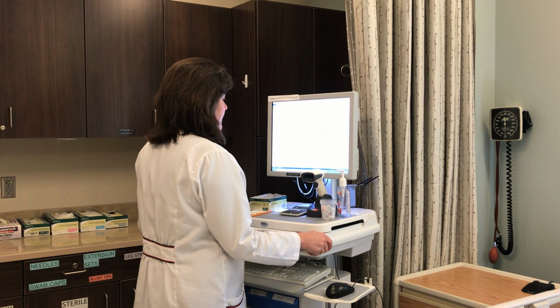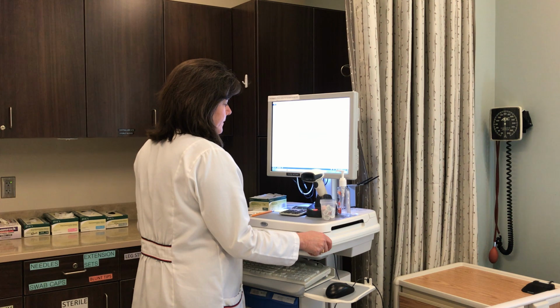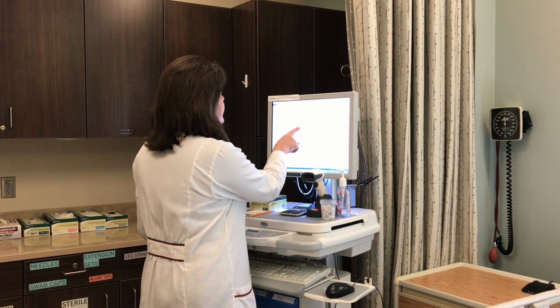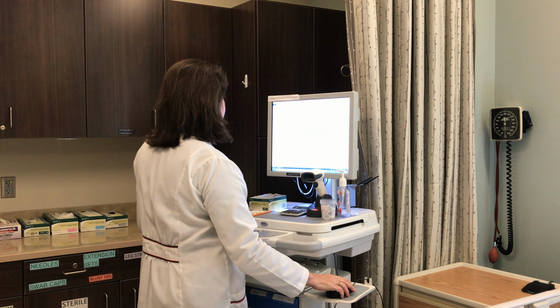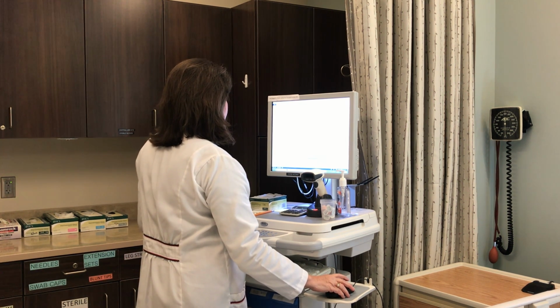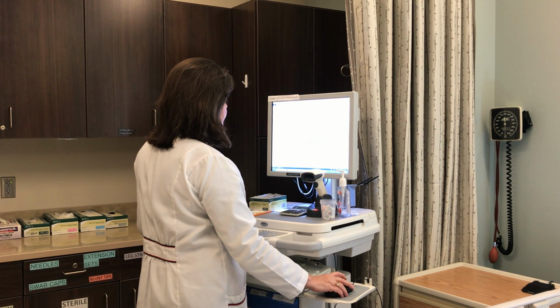This video will demonstrate IV push via peripheral saline lock, INT. Verify MAR and healthcare providers' orders for medication. I'm checking the physician's orders in the MAR for Diane Curtin. The medication ordered is Solumedrol 200 milligrams IV push. Review allergies. The MAR says allergies are NKA, which is no known allergies.